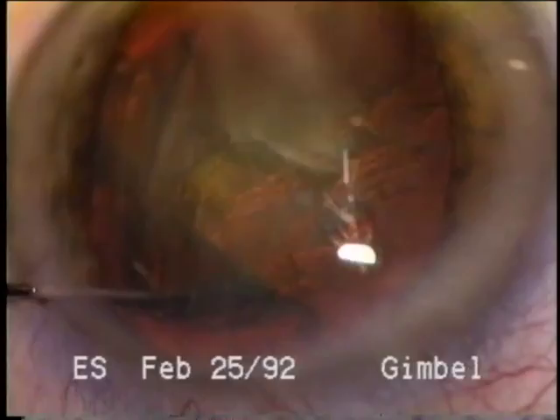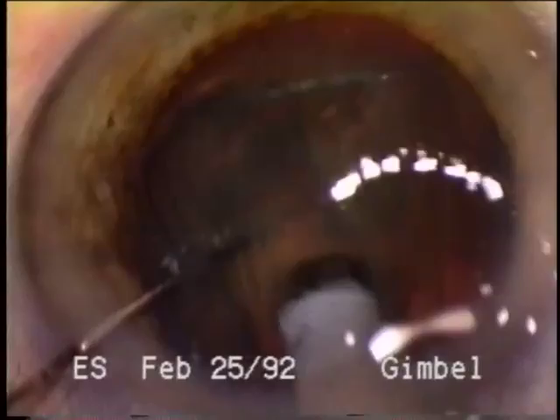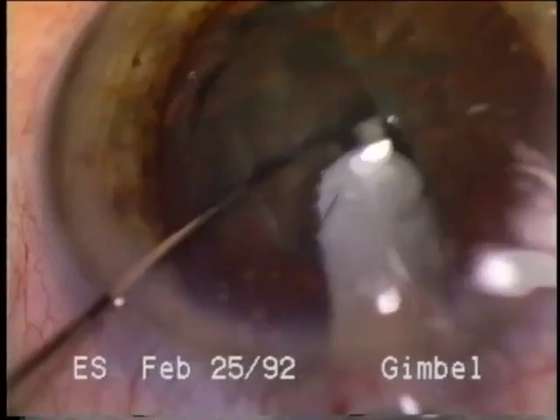It is very important to ensure that one has an adequate opening in the anterior chamber to avoid pressure buildup and a possible blowout of the posterior capsule or rupture of zonules. Although partial hydrodissection may be adequate for some phaco techniques and may be unnecessary in some soft cataracts, hydrodissection facilitates most variations of the divide-and-conquer nucleofractus techniques of phacoemulsification.